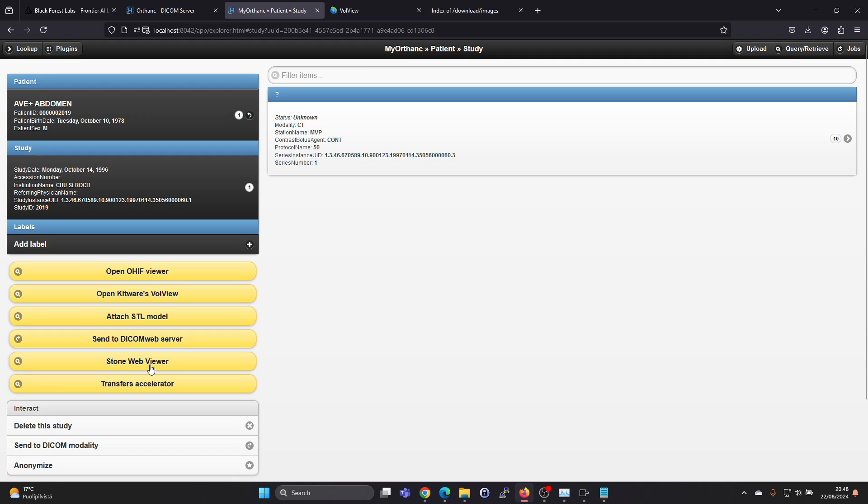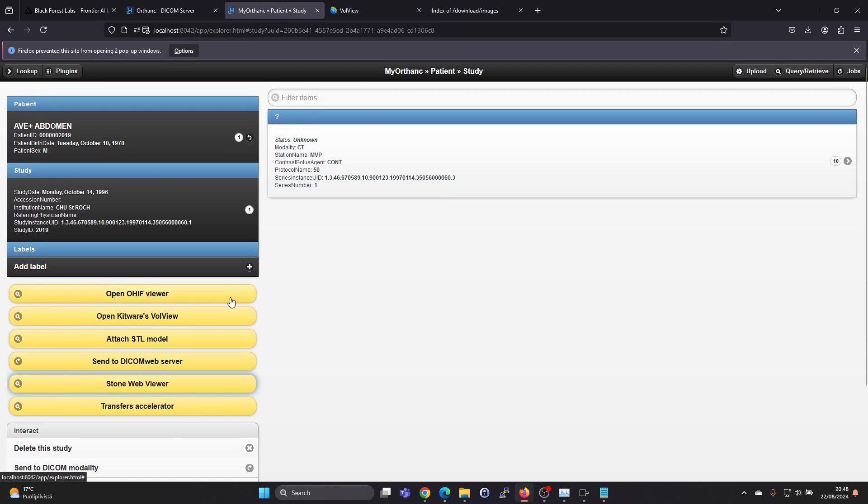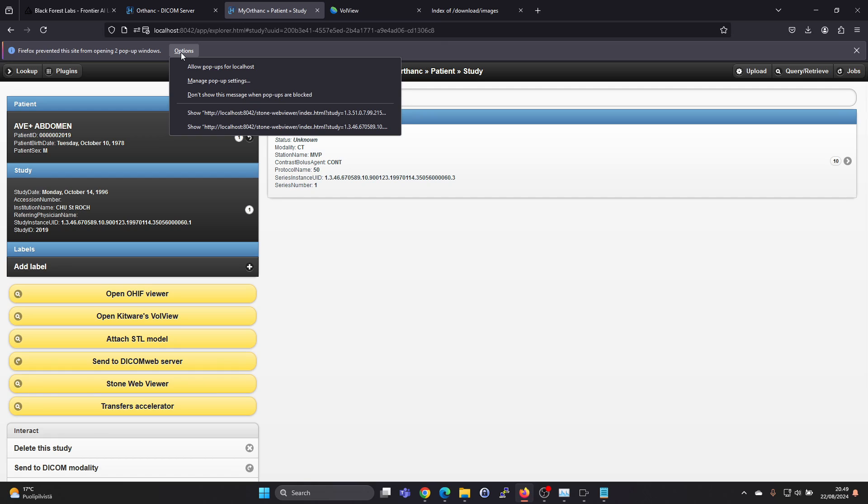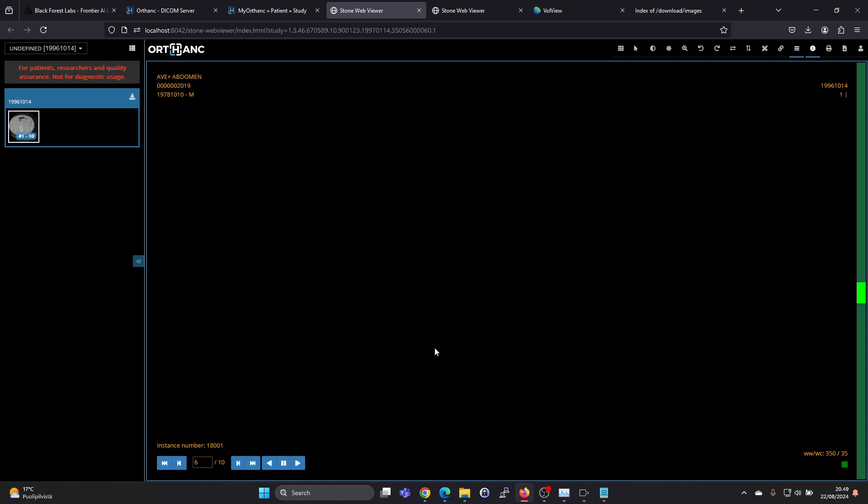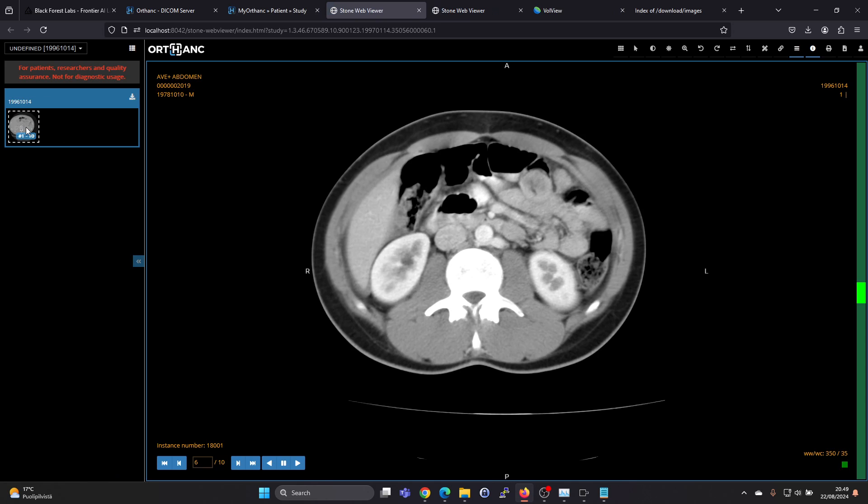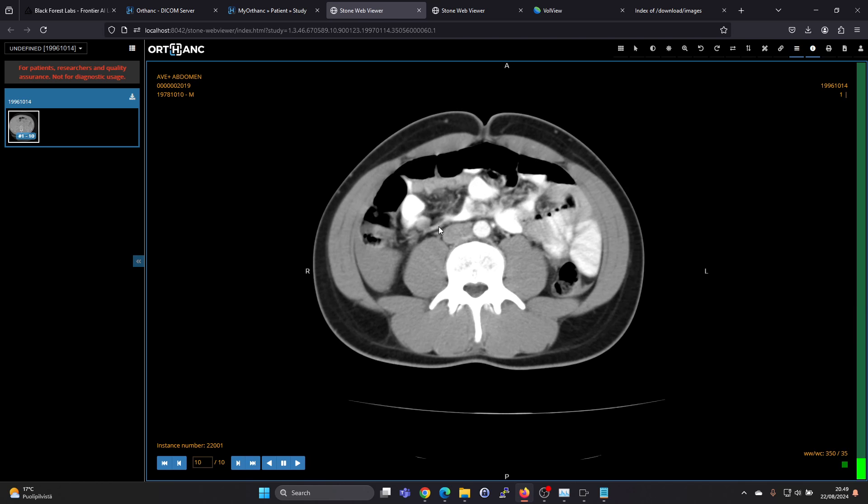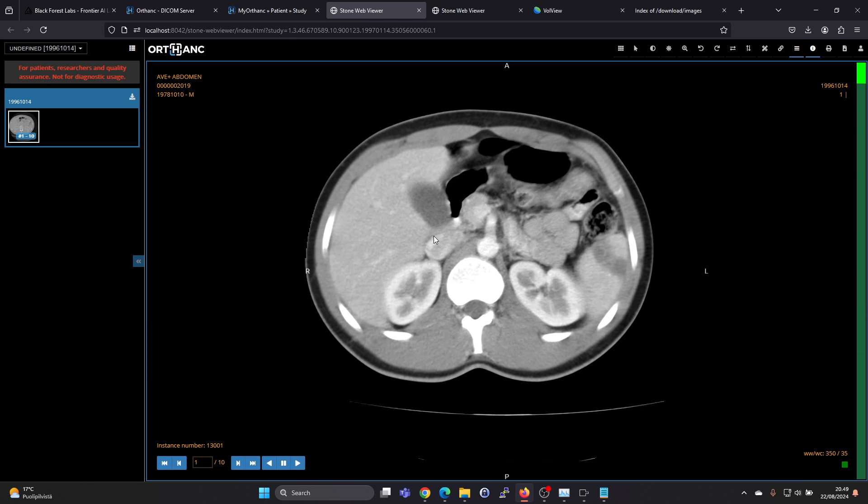And there is StoneWeb viewer. So there are multiple viewers built into this. This one, it says Firefox prevented. We can click on options, allow popups for localhost, and we can view the study here as well.